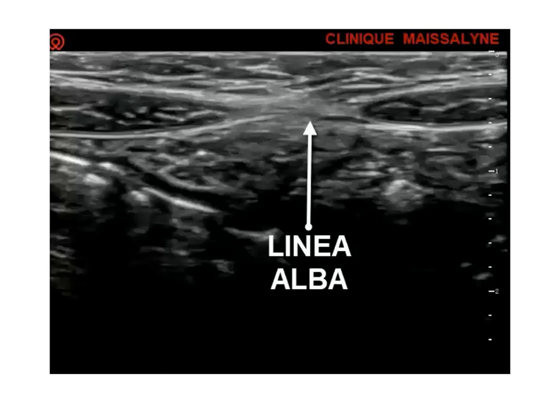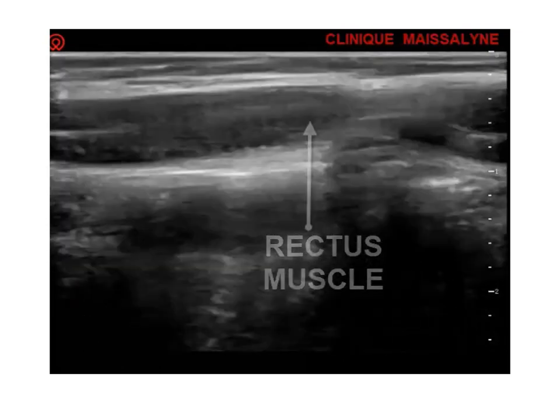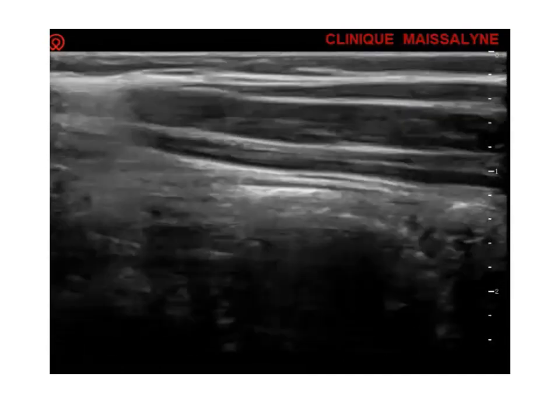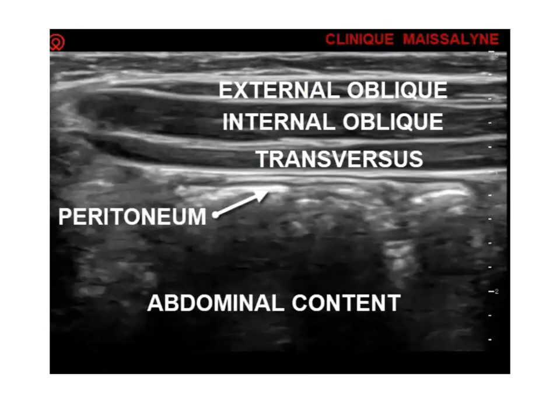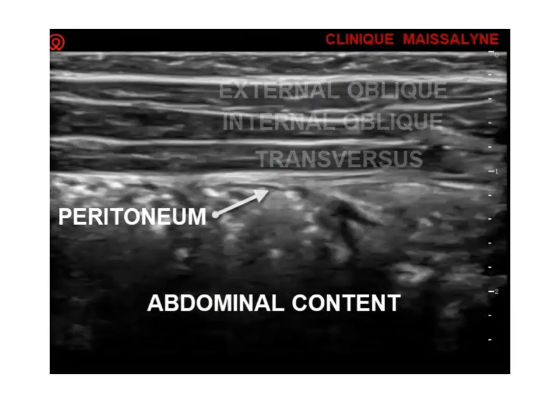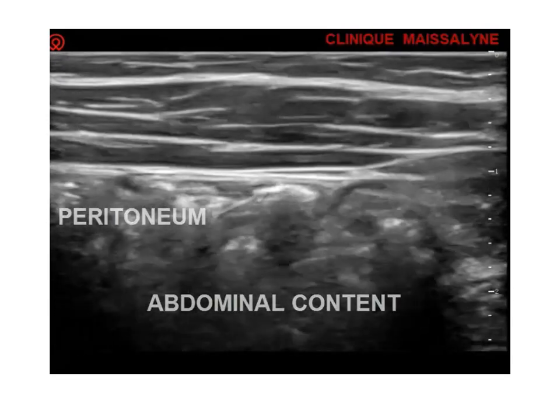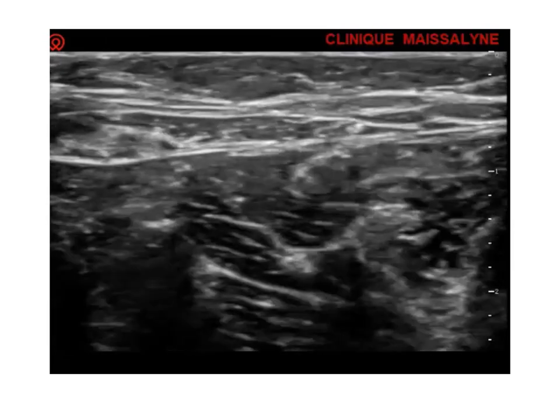The ultrasound transducer is then moved laterally along the midaxillary line. The three muscles are then identified. Identify the abdominal wall muscle layers: skin, subcutaneous tissue and fat, rectus abdominis muscle, external oblique muscle, internal oblique muscle, transversus abdominis muscle, transversalis fascia, preperitoneal fat, peritoneum, and abdominal content.